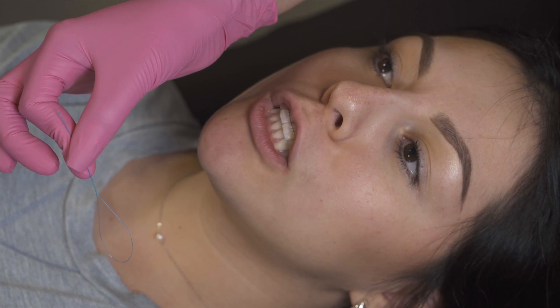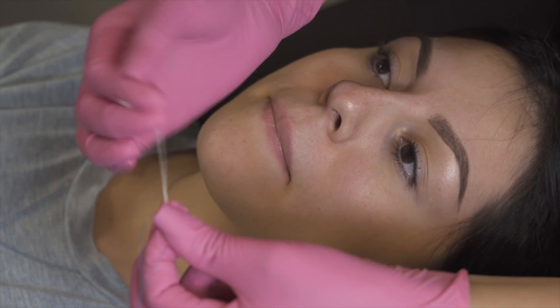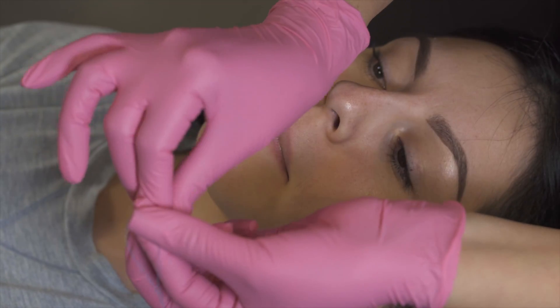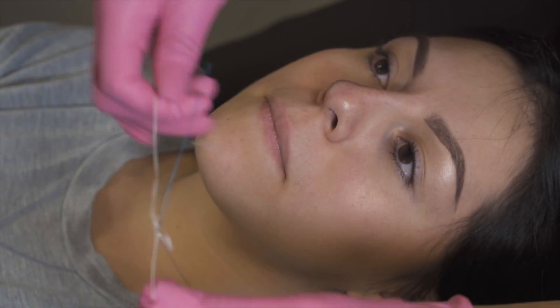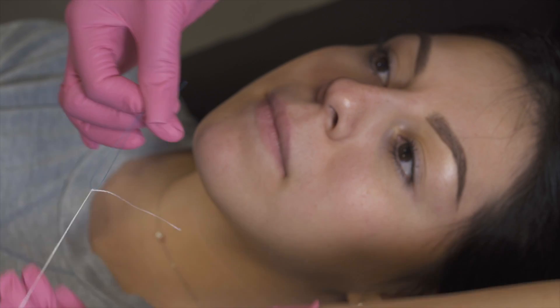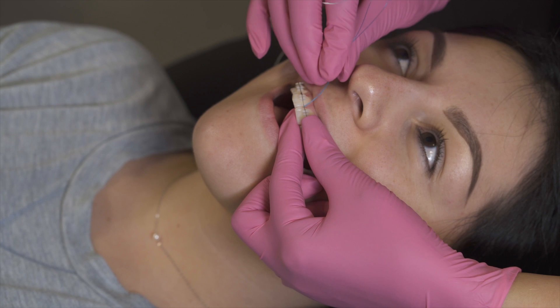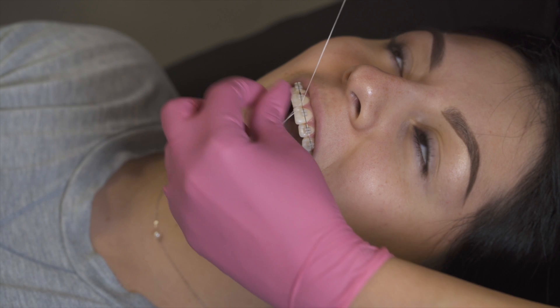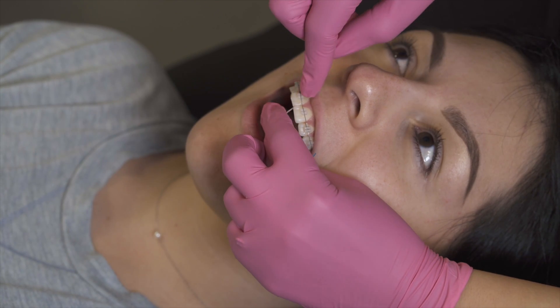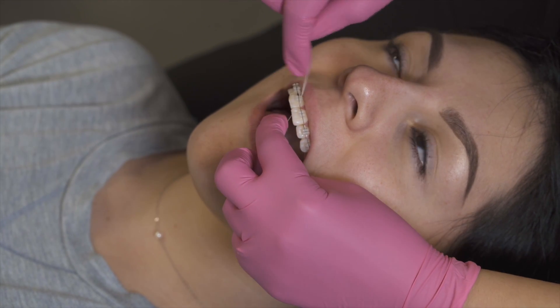The second way to floss is to use the floss threader. You're going to grab your floss and thread it through. I like to tie it so it stays on there — makes it easier — so you just tie a little knot. Now you're going to grab your floss threader and go right behind the wire and then thread it through. Once you've threaded it through, you just slide up and kind of create a little V-shape here and get in between the gum tissue.